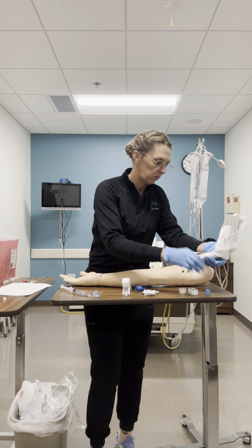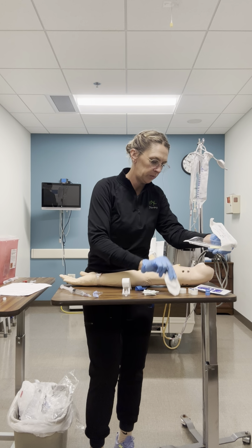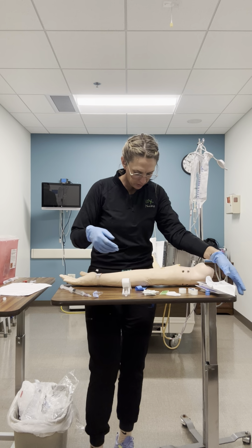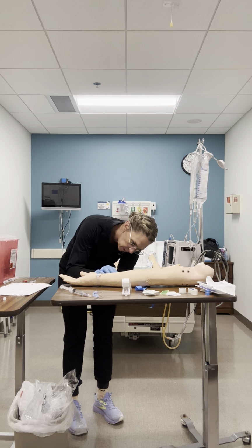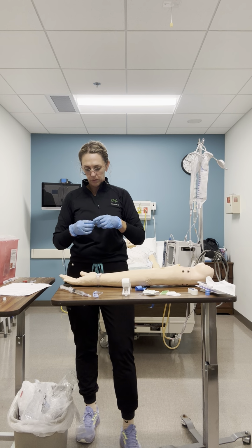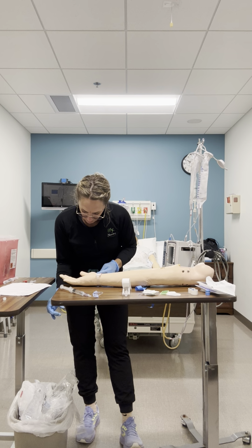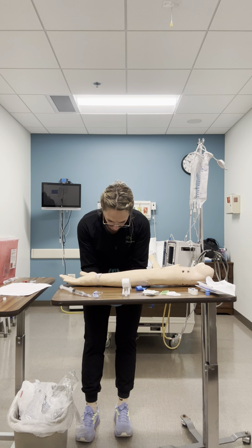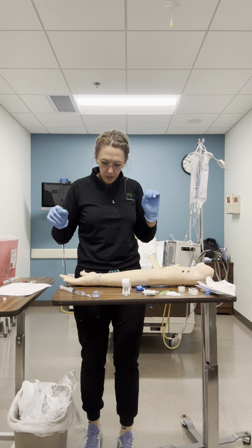Most of it I already have. I'm gonna use that. We will use these. Okay, the rest of that can just go there. I have some tape here that I've prepped as well. I'll do another piece. Okay, here's some tape. We are ready to go there.